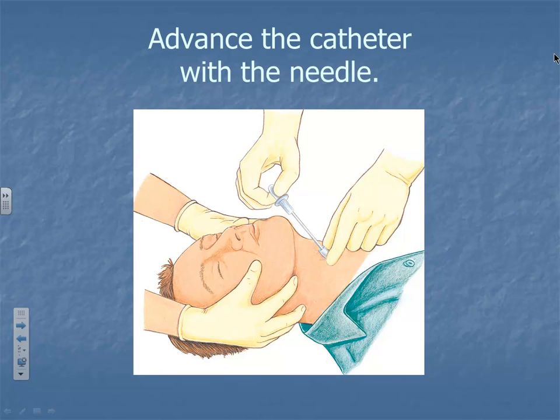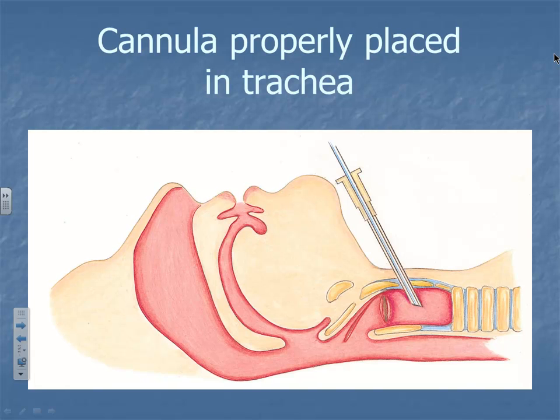It's kind of like you can do this with a really large gauge IV catheter. It's possible, if you're really in a pinch. Okay, here you can see you're kind of going at an angle. You don't put that in very deep. And later on we're going to actually cut this tissue and go in. It's really going to depend on what type of device your service is using. I have not used this one. We use the old cut it thing.